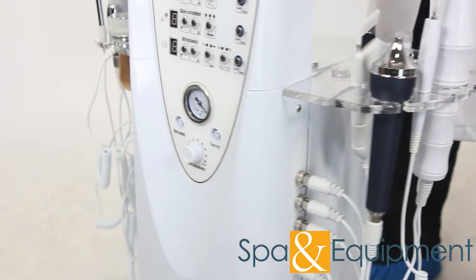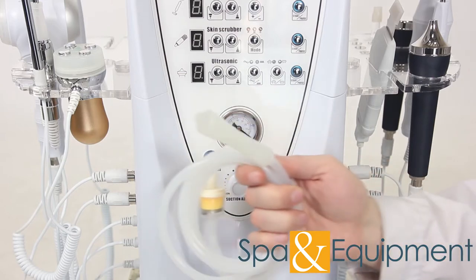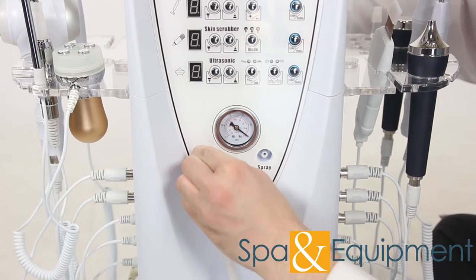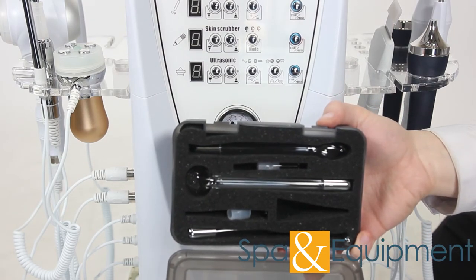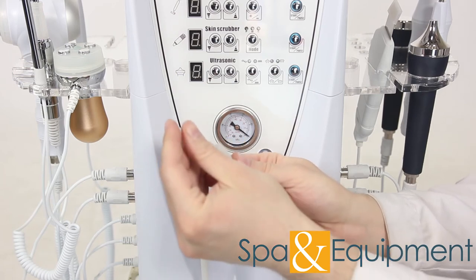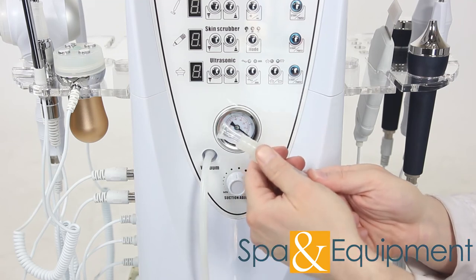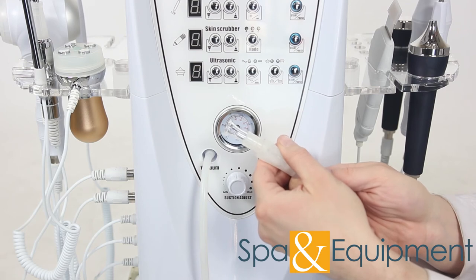Now let's move to the front of the unit. First we will connect the vacuum hose and handle. Take the hosing that has the yellow filter in the middle — the vacuum handle comes already attached. Take the other end of the tubing and attach it to the main unit. You'll find the vacuum handle tips in the same container as the high-frequency electrodes. You can attach a vacuum tip to the end of the handle by just pushing the tip onto the end of the handle. One thing to note about the vacuum handle is that there is a hole on the handle — this hole needs to be covered during a treatment if you want suction to occur. If the hole is uncovered, then there will be no suction.